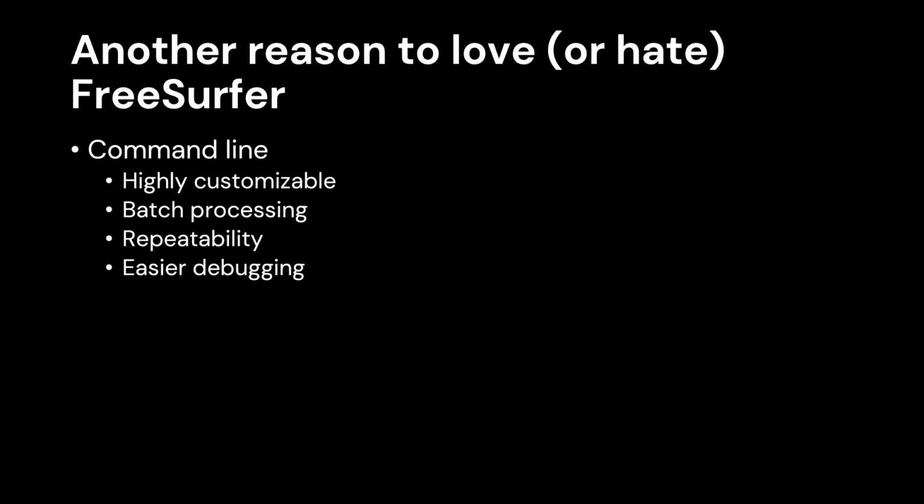But however, there's another reason to love or hate FreeSurfer, and that is that it uses the terminal and bash as the language to process the images. The reasons why this is useful, or actually good, is that it is highly customizable. It allows for batch processing.